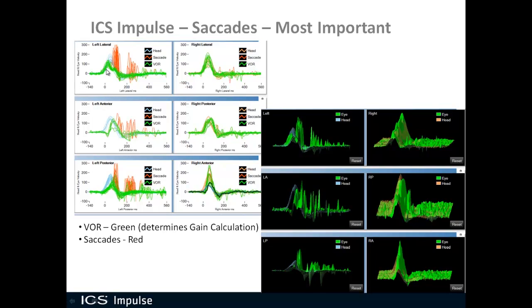In the 3D view, the eye is always green and the head is either blue or orange for left and right. Catch-up saccades for the left side are visible while the right side has none. Catch-up saccades can be viewed in either 2D or 3D view.